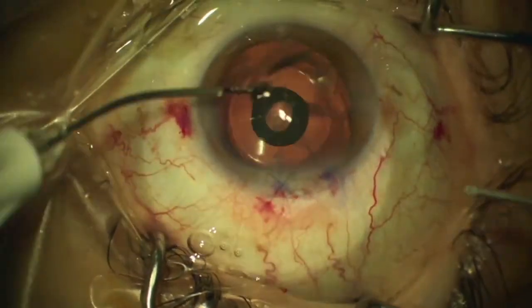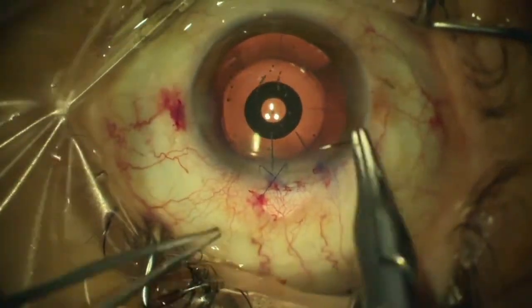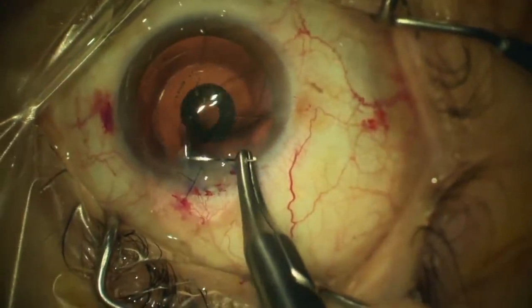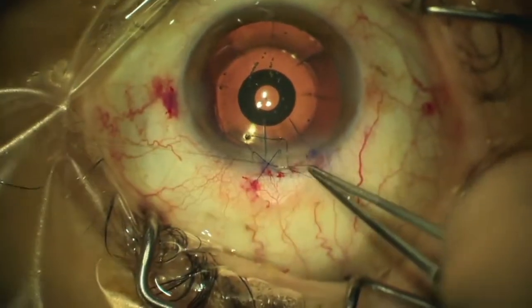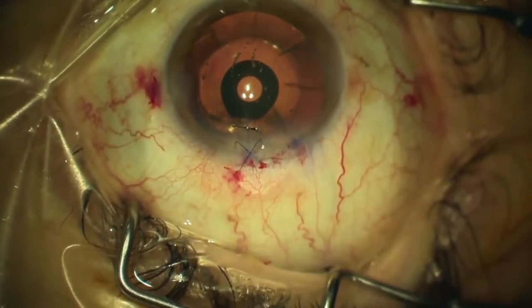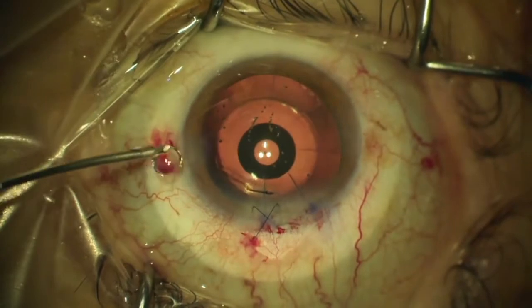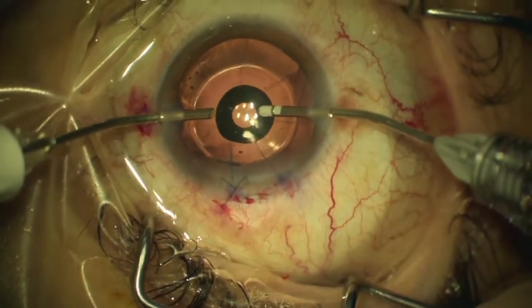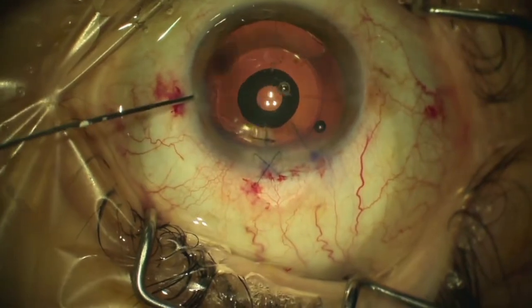Is it waterproof now? No. So a second suture now has to be placed in order to close the gap. Hopefully this is going to be the last one. It looks good. Now the wound is sealed and the procedure can be finished with instillation of antibiotics and subconjunctival steroids.